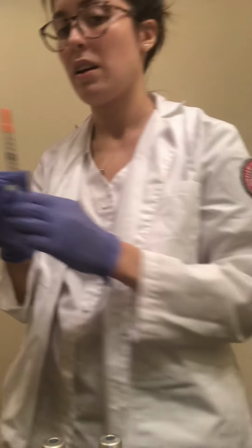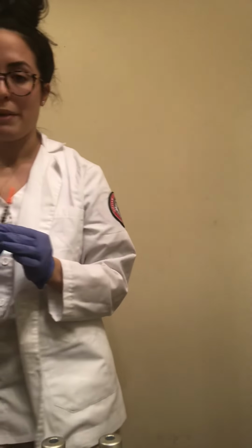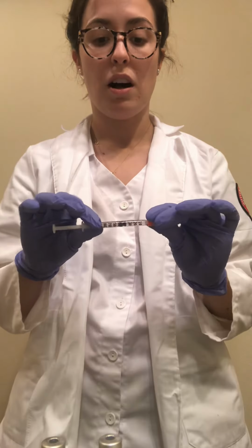All right? Miss Michelle, can you verify that this is 40 units of insulin, 20 of the NPH and 20 of the regular, based on the MAR for this patient, Mr. Olaf Michel? All right, great. So everything's ready to go. The very last thing is taking off my gloves and then going into the room to administer the insulin.